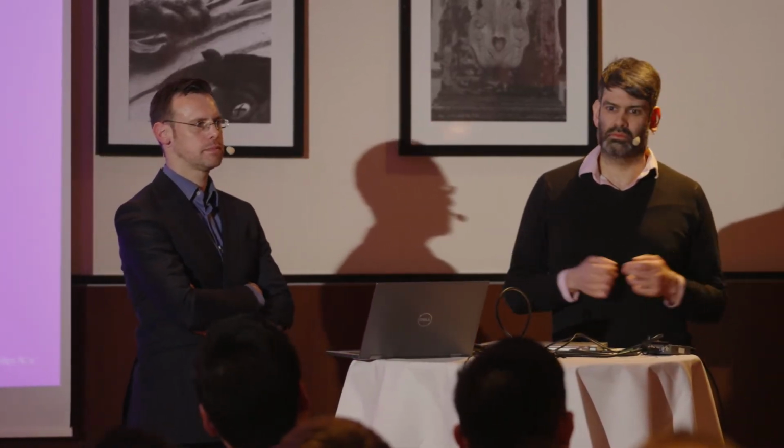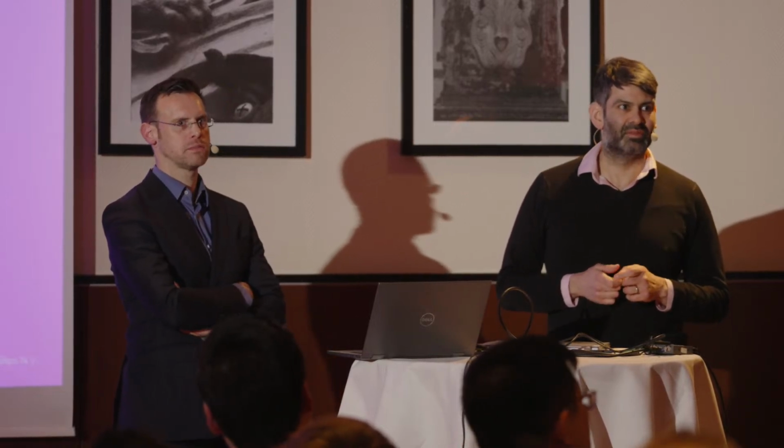Dragging everything slowly towards you as you go more and more distal. Definitely done that. And how far distal can you go? Or have you been? DP, lateral plantar. Yeah, into the foot. Well into the foot.